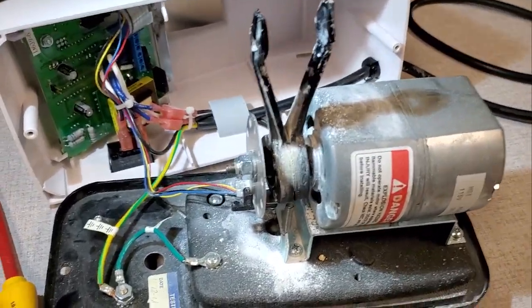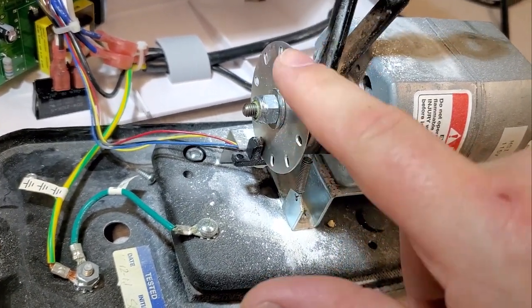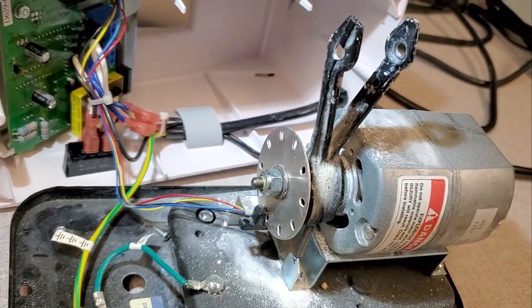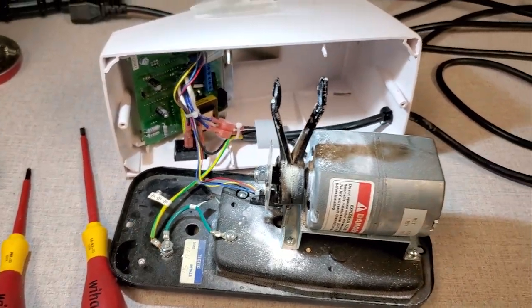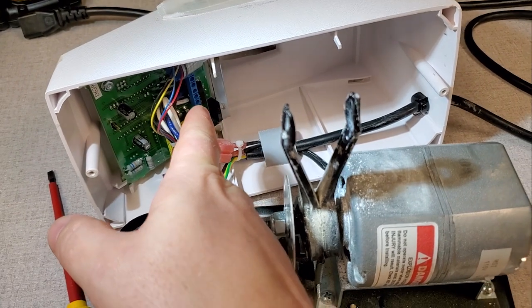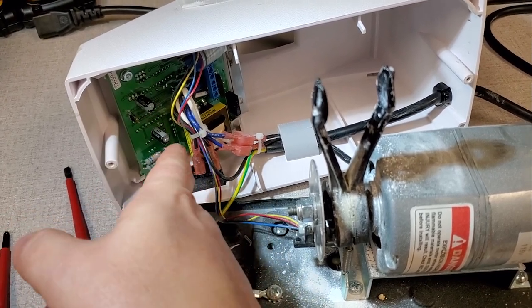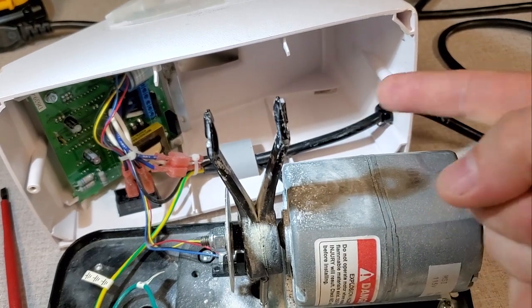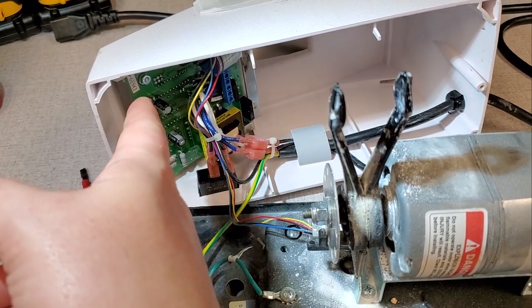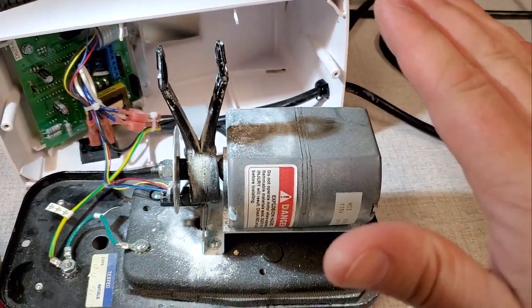This one doesn't really have a speed control. In fact, you can see down here, it's got this optical interrupter and this perforated disc, which actually helps it to start and stop the timer and maybe detect errors if there's a problem with the motor. But with this motor here, the AC comes in and you can see that right over here is a full bridge rectifier, and that's stripping off a little bit of that AC wave for DC to run your circuit board, and the rest goes up into a large transistor, which is on the other side of the board right over there. And when you press the go button on the DC side, it clicks over that transistor, which closes the circuit, and AC comes here to the motor.